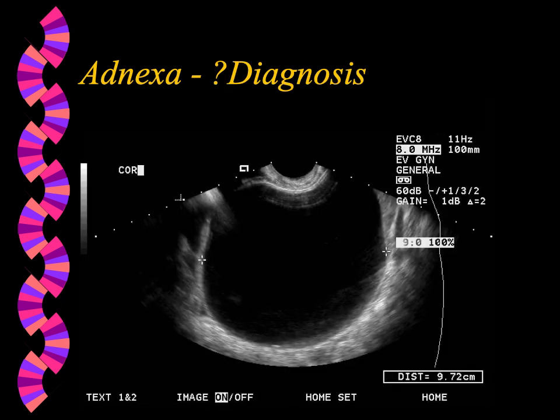So the patient's age is also critically important. And if we have a postmenopausal woman with an adnexal mass, that raises our level of suspicion. So this first image is an adnexal cyst. You can see the measurement is 9.72 centimeters. As you look along the cyst wall, it's entirely smooth, it's entirely simple, there are no septations.